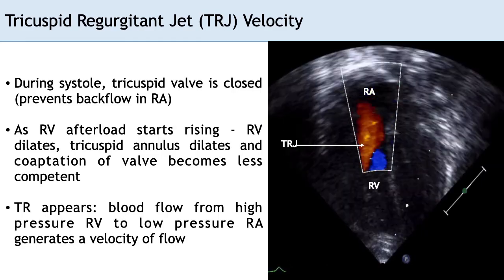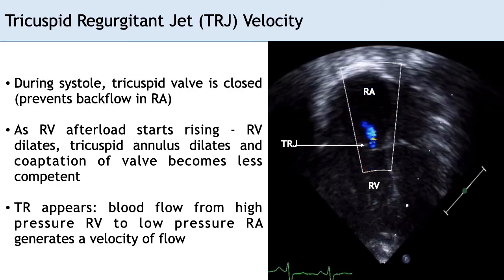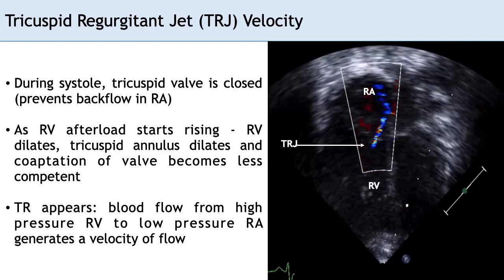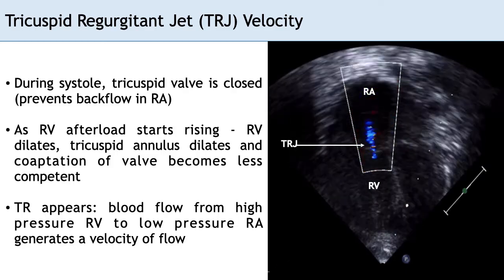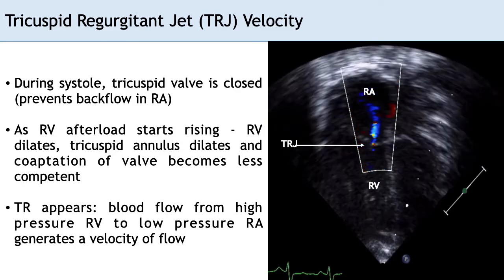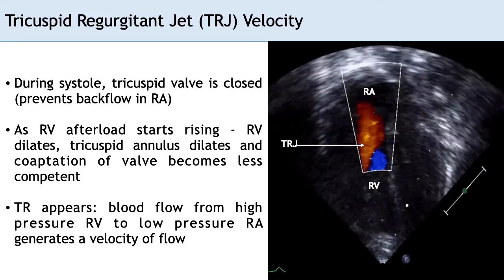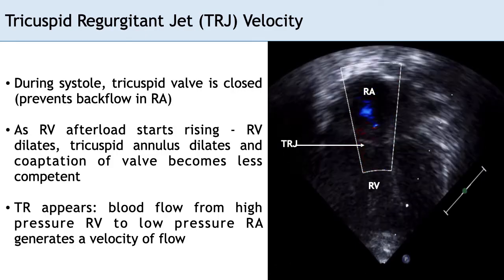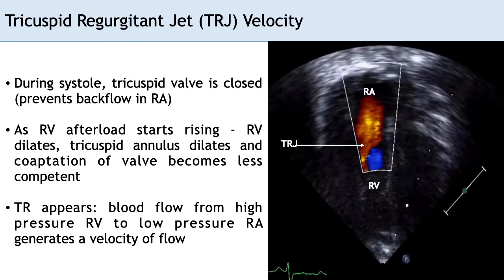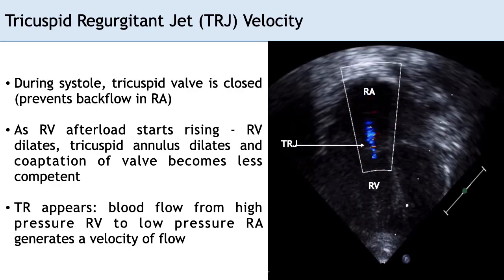The other thing is that, to generate velocity, you need to have a pump that works. And if your right ventricle is failing to a point that it has difficulty generating any kind of velocity, you may have very low pulmonary arterial pressure, but that's because you have very low flow in the pulmonary artery, and that does not necessarily reflect the underlying distal pulmonary vascular resistances. So to generate pressure, you need to have a pump that works. But as the patient is having progressive failure of the right ventricle, you might lose some of the appropriate correlation between pulmonary pressures and the degree of pulmonary vascular resistance.